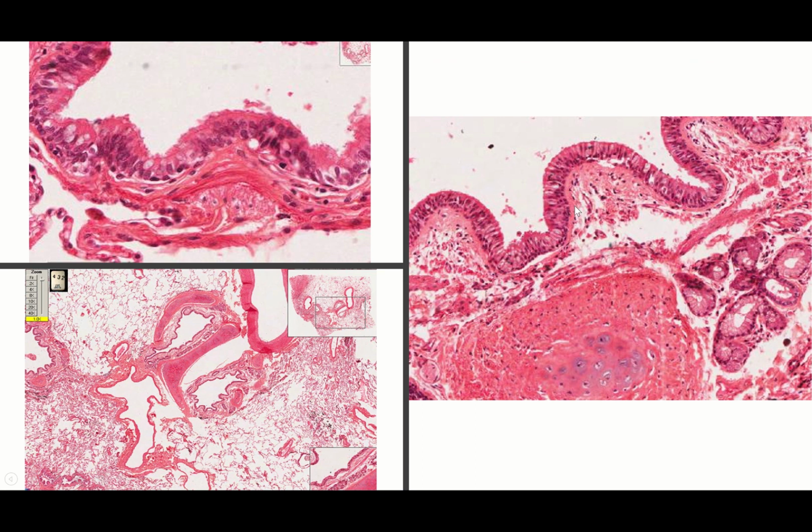Okay, so here we're going to look at more examples of that. If I were to ask you what you thought this big tube was, hopefully you would tell me you think it's a bronchus, right? Because you see these cartilaginous plates surrounding this. It's really big, really thick, but it's not like the trachea. There's only one trachea. It's not a complete huge ring of cartilage, but there are cartilage plates, so that would still be a bronchus. This one right here, where there's no cartilage around it, would be like a bronchiole, a conducting bronchiole.